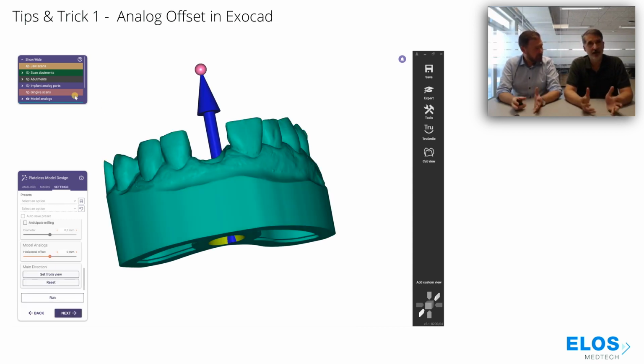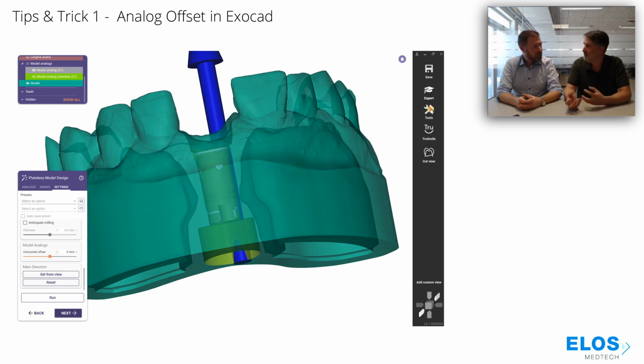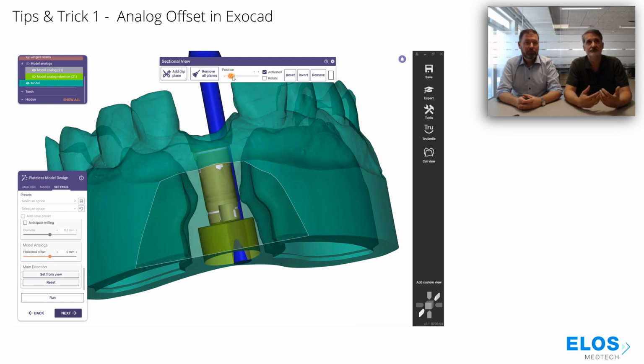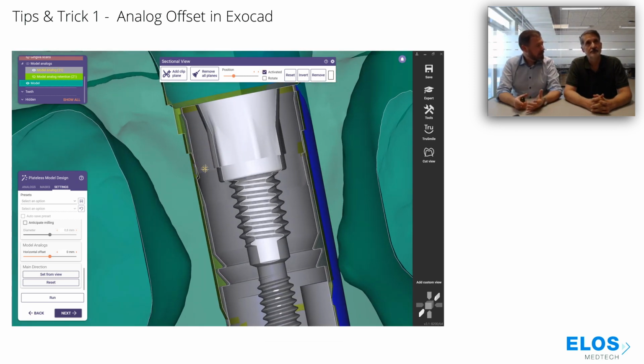When you generate your model, the placeholder file is exactly like in the library. But as we mentioned, we always have shrinkage in the materials, so the software also enables you to modify the offset. Okay, so you can actually control it, and this goes back to the accuracy and the tolerances of the printer.